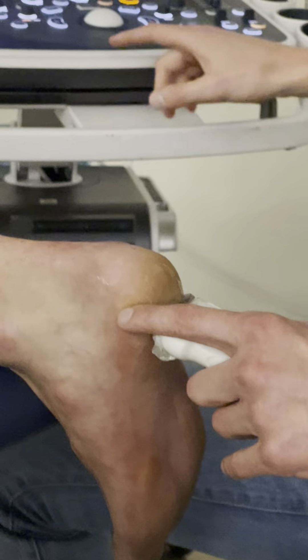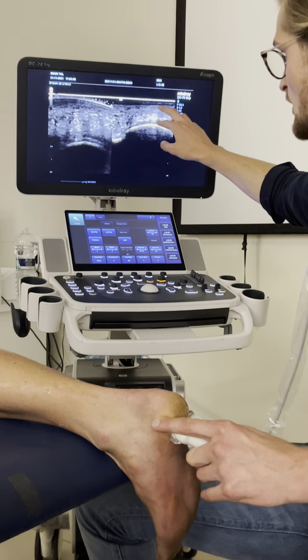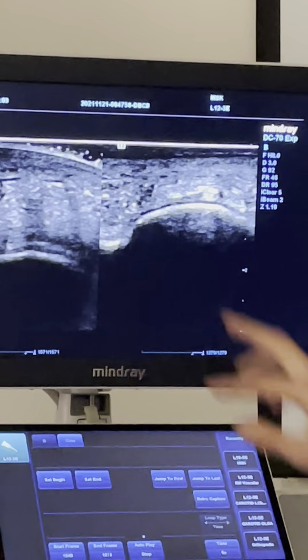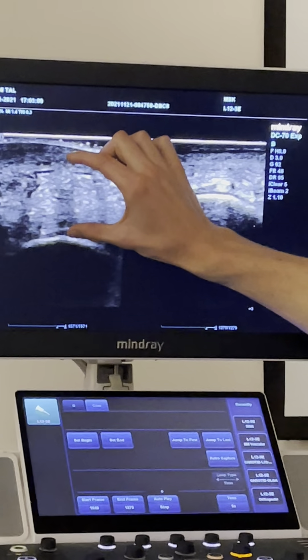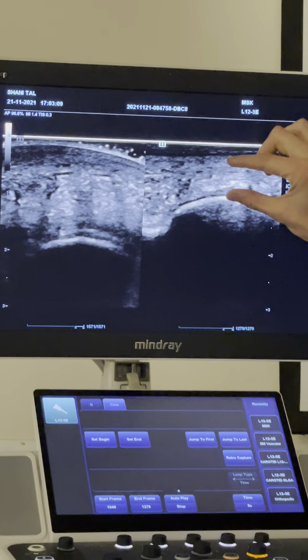And now I'm putting pressure, more pressure, more pressure — until there's no more collapsing of the fat pad possible. And then I freeze. Now I want to see the thickness of the fat pad here compared to here.